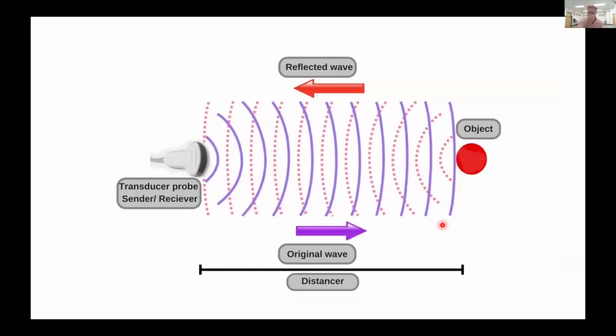So how does ultrasound work? You have a transducer that sends ultrasonic waves down into the body, and then those waves bounce back to the transducer when it hits an object, sending information to computer software to generate an image. Ultimately, the speed and strength at which those waves reflect back to the transducer determines how different structures will appear in an image. And so that speed and strength, the echogenicity, as we call it, of structures varies depending on their physical properties.